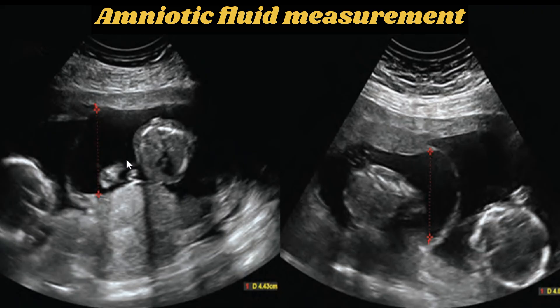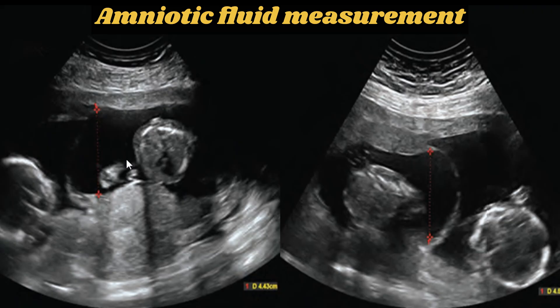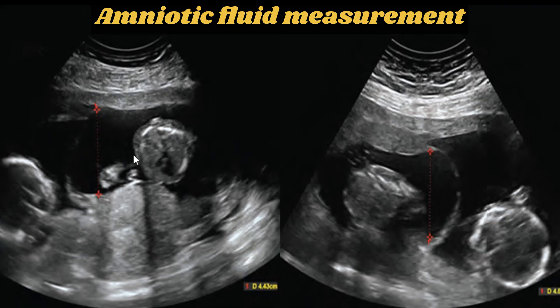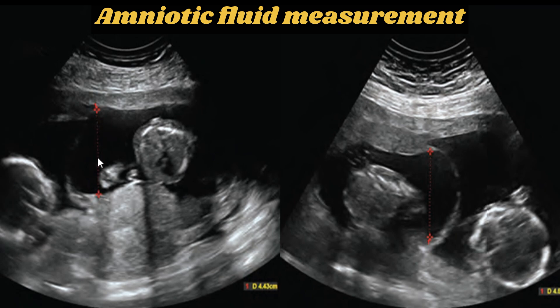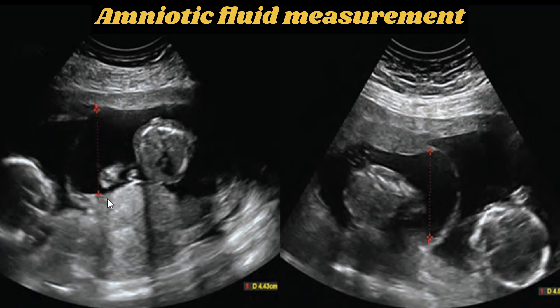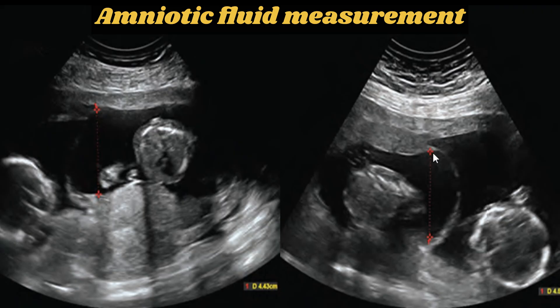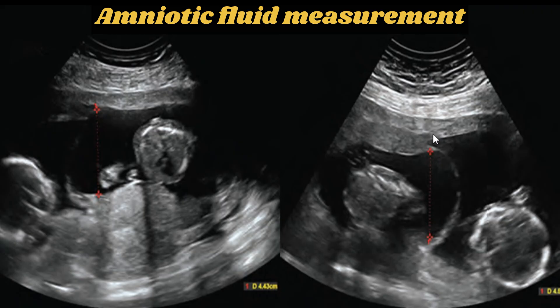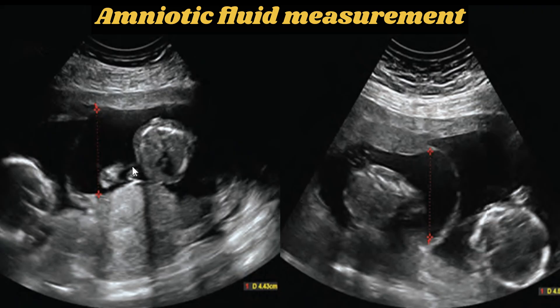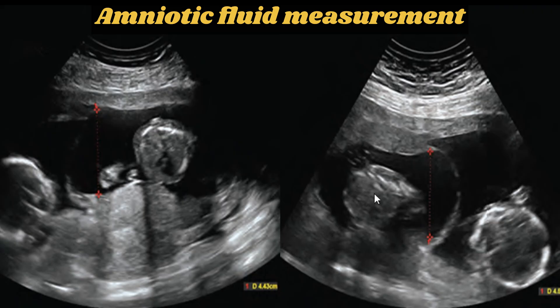The single deepest fluid pocket method is the most commonly used semi-quantitative method in pregnancies with more than one gestation. The single deepest pocket is considered too small if it is less than 2 cm, and too large if it is greater than 8 cm. In this case of twin gestation, fetus 1 has a deepest pocket of about 4.4 cm and fetus 2 measures about 4.5 cm — both have normal amniotic fluid volume.